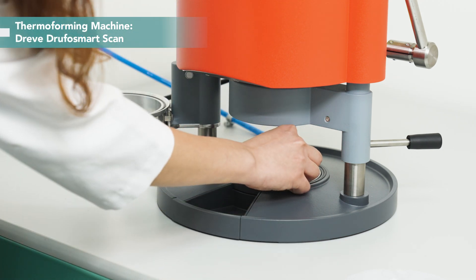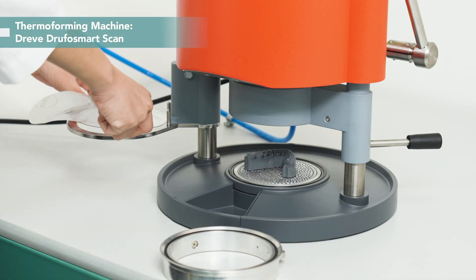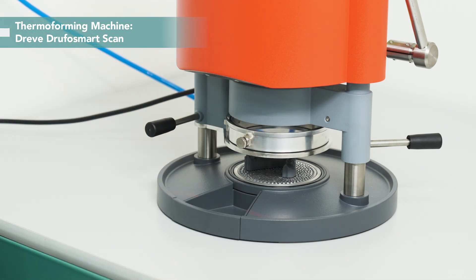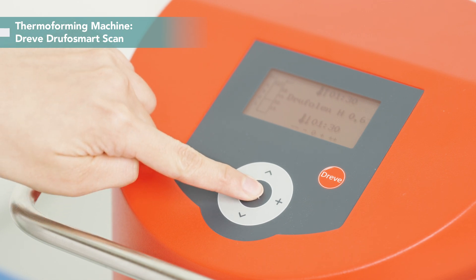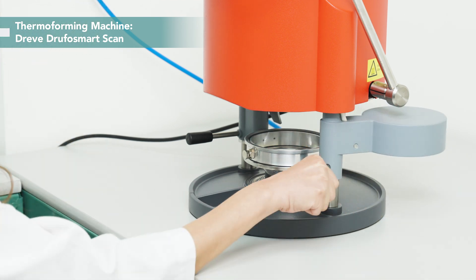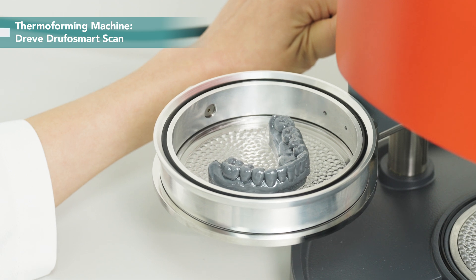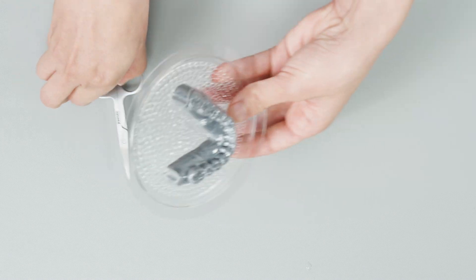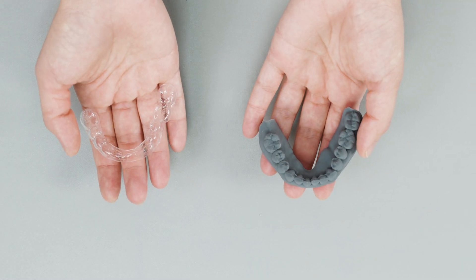Put the model face-down here. Place the sheet on top. Scan the code. The machine reads the parameters for heating — press OK. After about a minute, heating is done. Remove the heating element and press down. It's finished. Let's remove the extra material. Well done — here's the clear aligner.